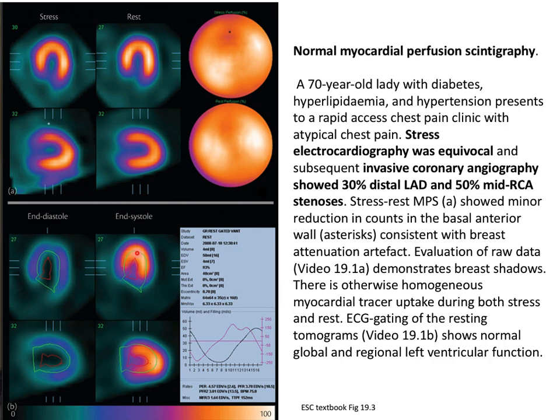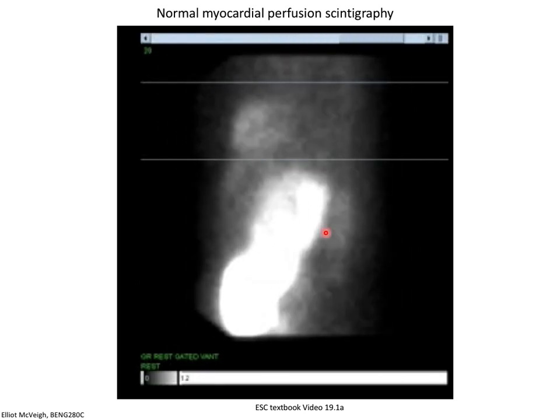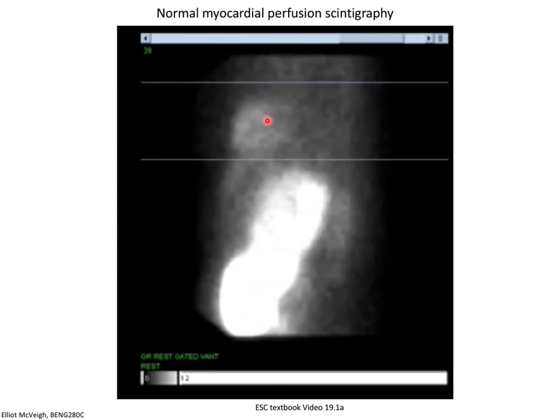And you can see that the signal intensity as a function of position goes up because all the heart muscle is coming together. This looks pretty normal. They've got normal function. I would not advocate using this data to measure cardiac function, but it's reasonable under these conditions, since you've got the data anyway, to take a look at it. I think I might. And so here's the normal perfusion of this person's heart.